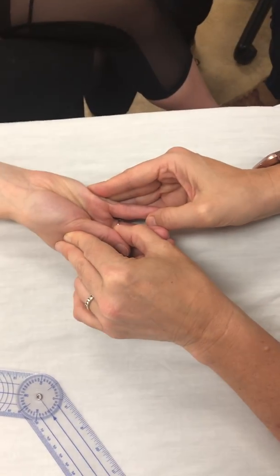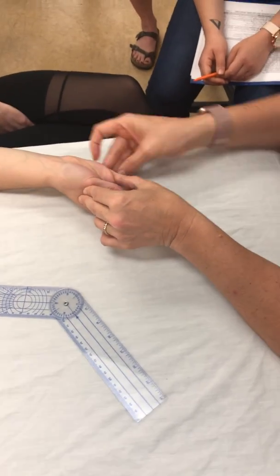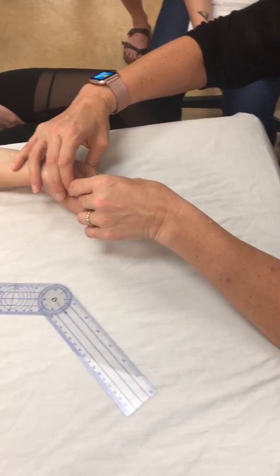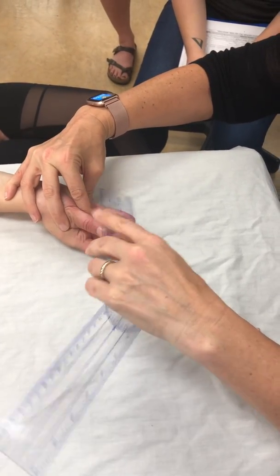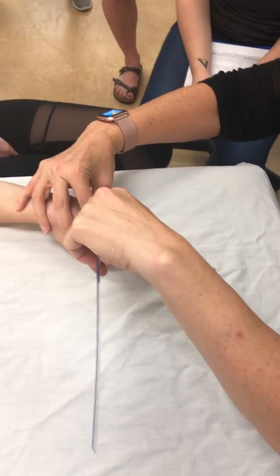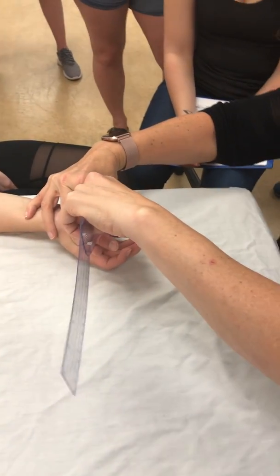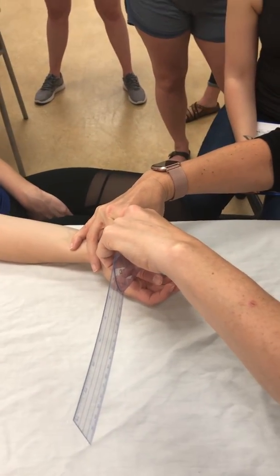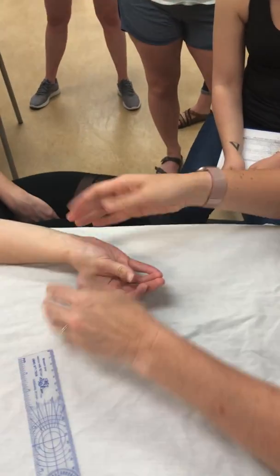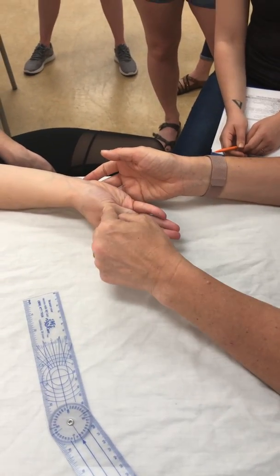Okay, so I've kept her in that position, and then I would take that measurement between the two. Now this has become a passive test, right? Because I'm pressing her, so I can use this, and I can stick it in the crease, and I'm getting 2.4 centimeters.